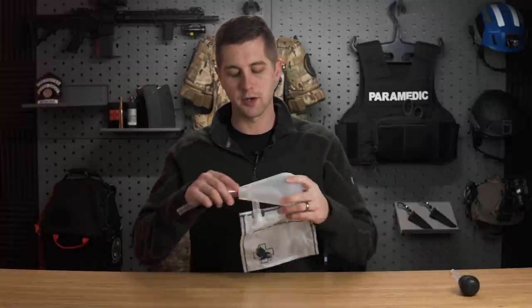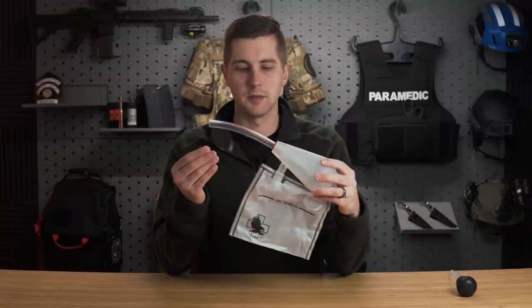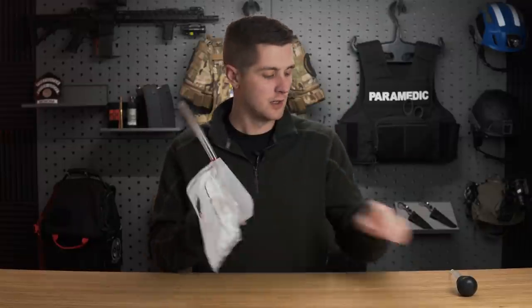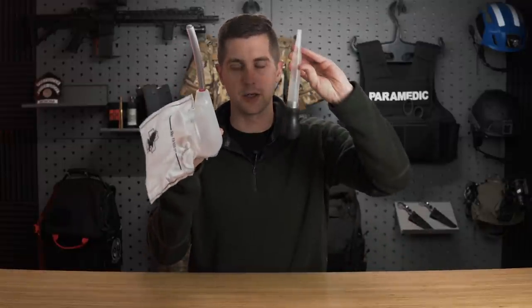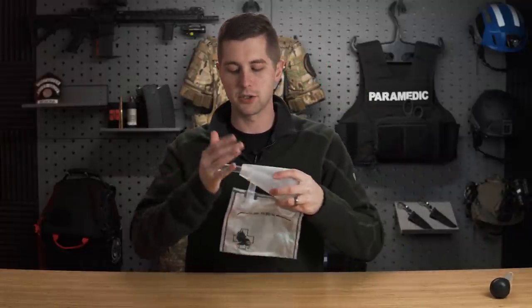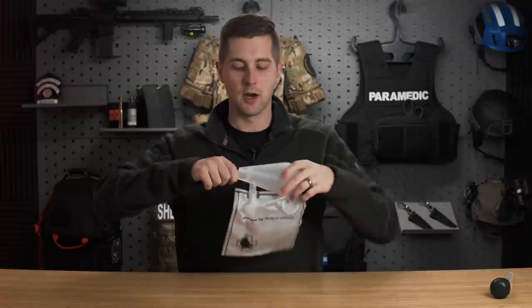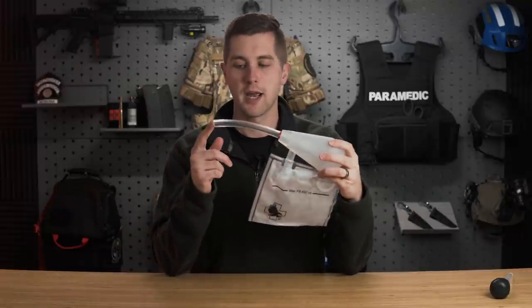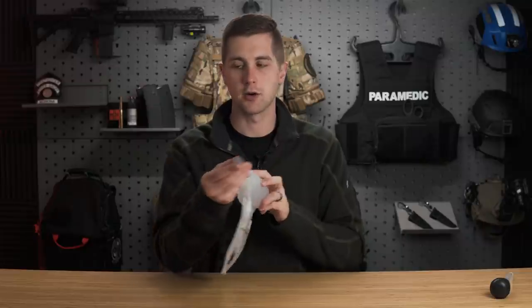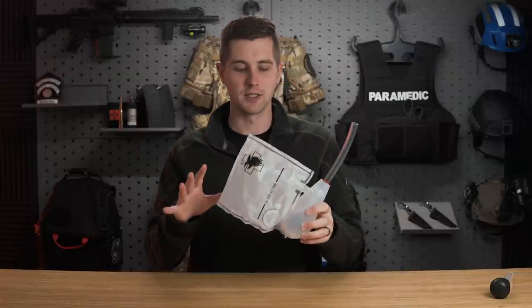Next, we have the North American Rescue bulb suction device. This definitely has its limitations and is reminiscent of a turkey baster, but it has a couple of big differences. Number one, it collapses down — the tube gets pushed in and it's a pretty small carry device. When we deploy it, we pull it out and we have a pretty long catheter. You can see right here on the tip it is relatively large bore, so we can get some of the bigger chunks out.